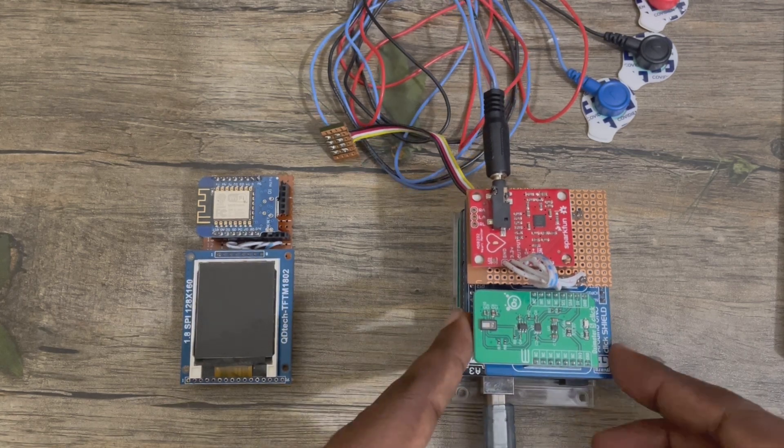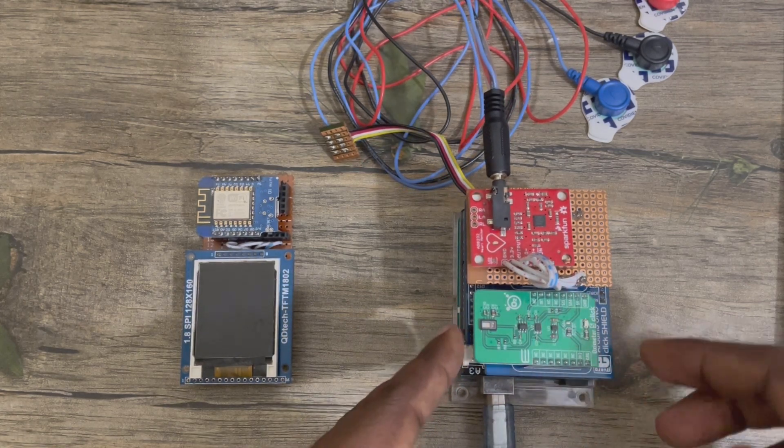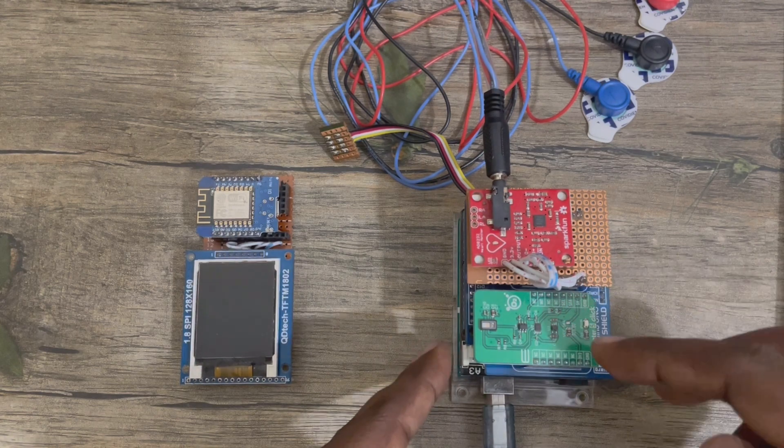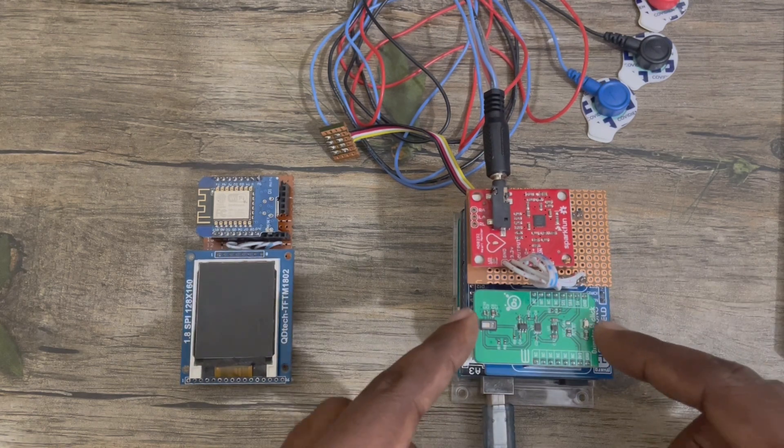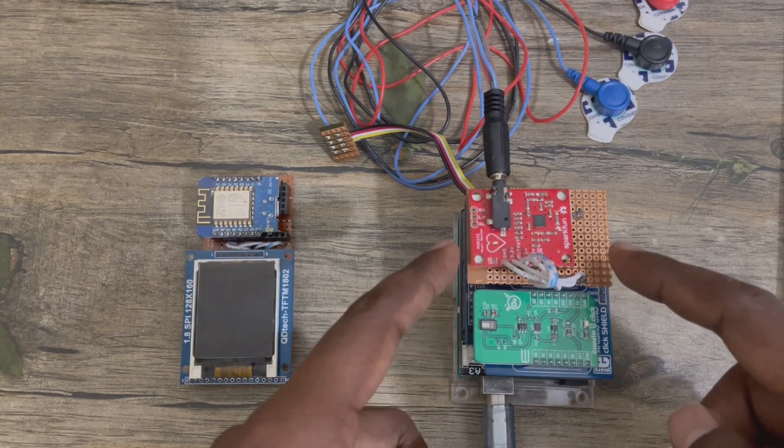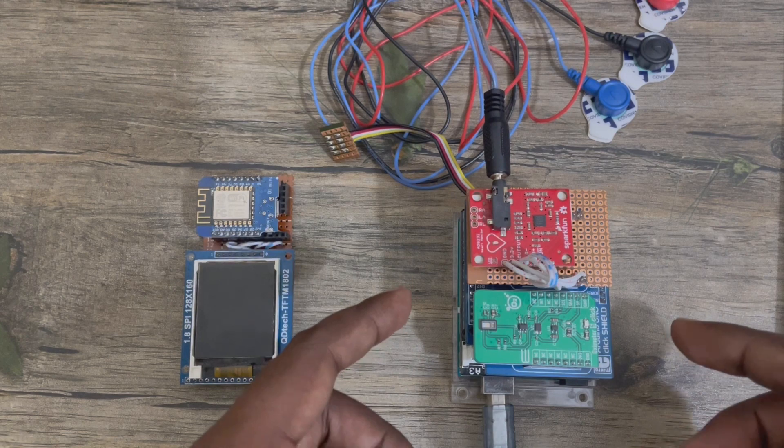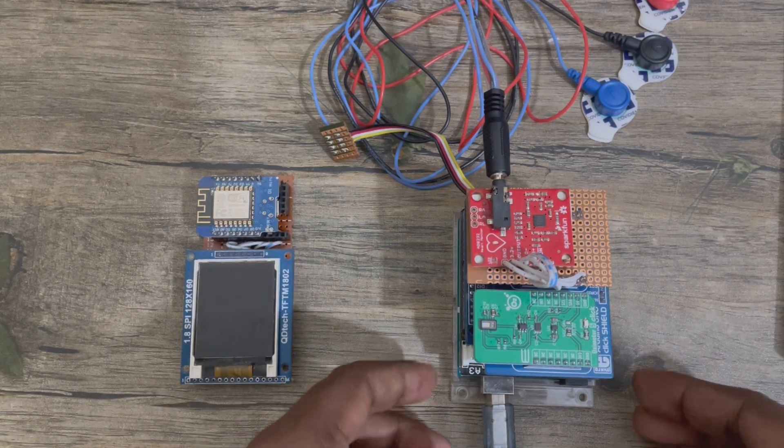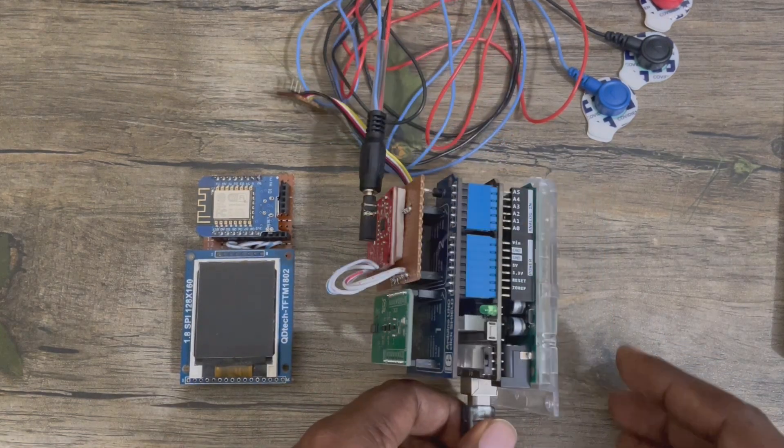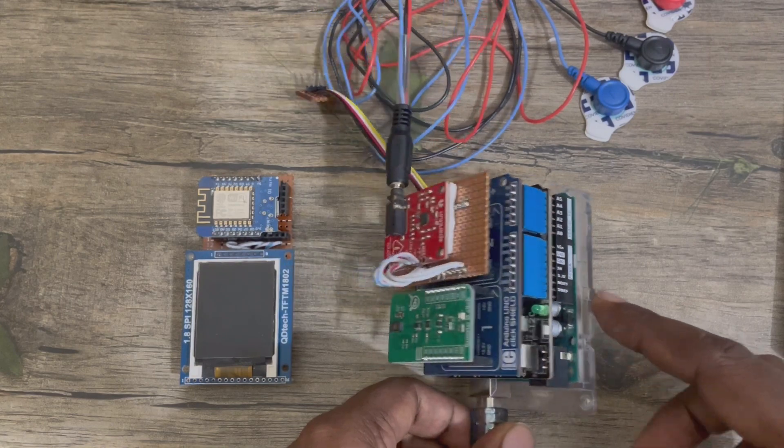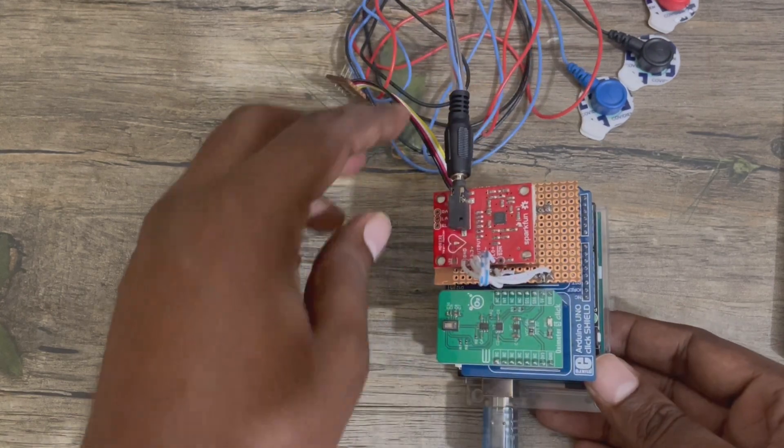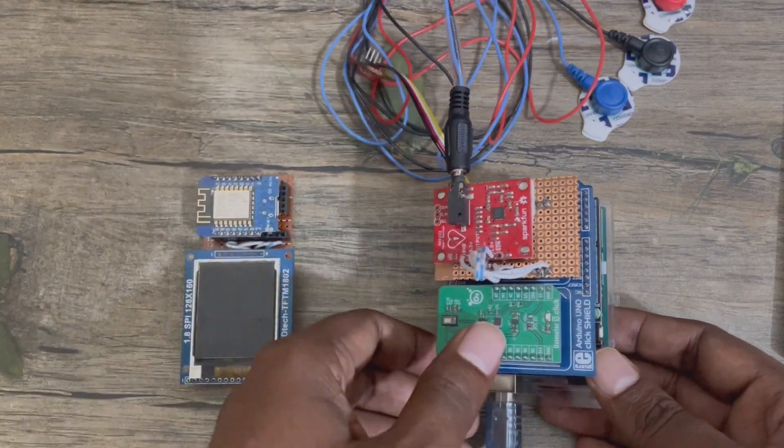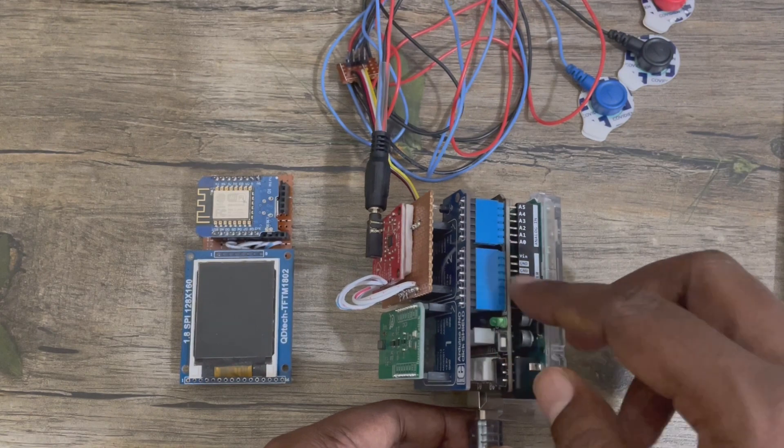This unit has two parts. This is one part. This is actually the sensor unit. The oximeter 5-click and the ECG module.